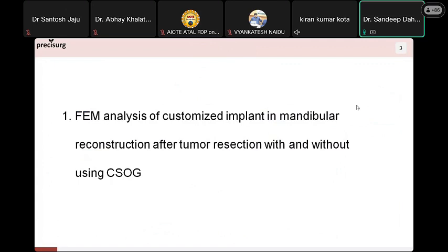In the screws it varies from around 0.001 to 0.006, and in the screw holes from 0 to around 0.04. This data is of the patient 1 result. Same procedure applied for patient 2. These are the results of patient 2. And for patient 3, for all the 4 cases.